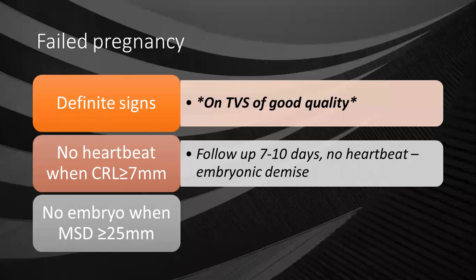But as people took into consideration that there might be mistakes in measurements, and as you know, ultrasound is operator dependent, they noticed that some pregnancies which had a chance of being viable were being terminated because of this cutoff value. So they had to take into consideration that intra-observer variability, and eventually came to a cutoff point of 7 millimeters.